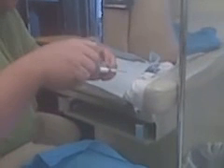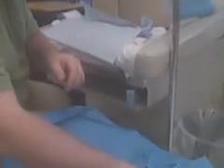And here we actually have some places to have a glass syringe. With that syringe, it will be for my spinal anesthetic. I'm going to put on my filter straw, or use a filter needle, whichever one's available. And we're going to draw up the bupivacaine. And I'm going to draw up 1 cc. I want to make sure I have a little room in the syringe regardless. And hopefully I won't lose anything here.